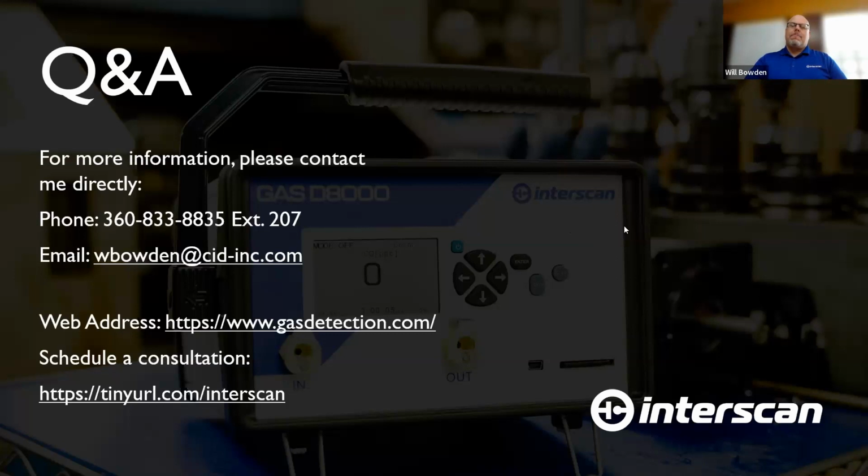So we got a quick question here. Can I wirelessly view data from the instrument via Bluetooth or Wi-Fi? On the portable instrument, we do not have Bluetooth or Wi-Fi capability. On the AccuSafe, it's not built in. However, because we do communicate via RS-485, you could take the output from the AccuSafe instrument itself to a Bluetooth module or a Wi-Fi module, and then monitor that wirelessly. Obviously, that's a case-by-case basis, and we can have a discussion on the feasibility and what hardware we would need to make that happen.